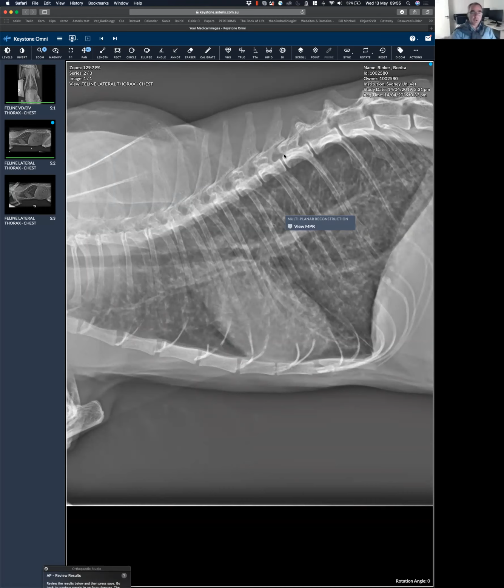We're going to bring unusual cases. The reason I think this is important is that as a primary veterinarian, like a GP, knowing how to read abdominal radiographs is super useful. It's easy to do, and it gives you so much information. So I was interested in bringing that to a little bit of an end, and to bring a group of cases around the same idea. And then probably the next thing would be thorax, which again is extremely important and extremely useful.